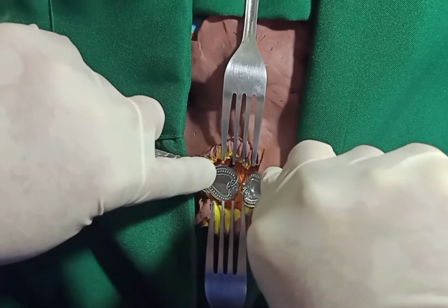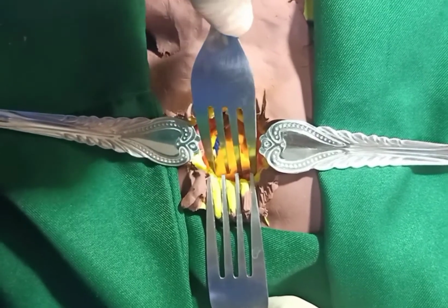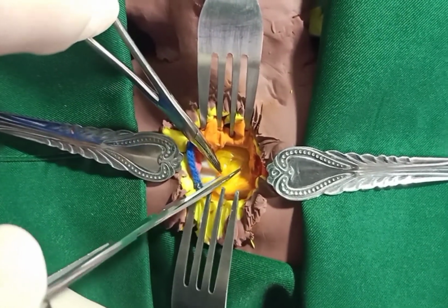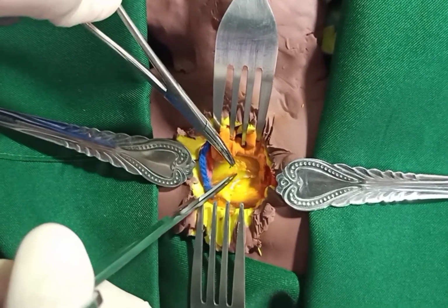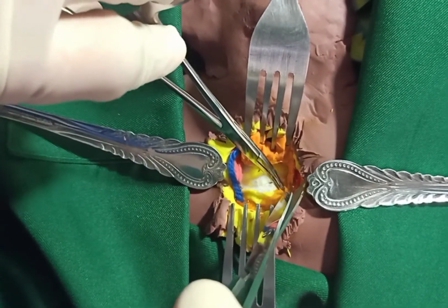Now we can see the thyroid isthmus overlying the second and third tracheal rings. So we now retract the isthmus superiorly to expose the trachea. Now expose the infrathyroid trachea by carefully parting the overlying soft tissues with a pair of scissors, taking care not to tear the inferior thyroid veins. This is visualized by the blue string as seen in the setup.